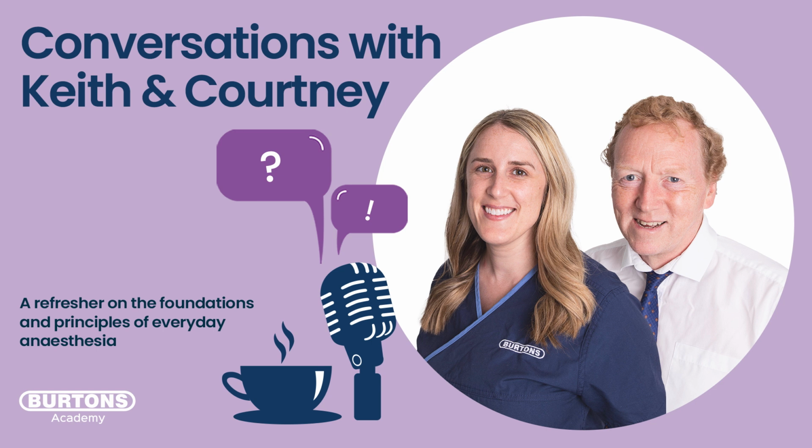No, I think it's really important, because anemia is certainly something I've had in cases before, where we're doing a bone marrow biopsy, for example, and they have a PCV of 9%. These cats are not so bad when their PCV is 9%. If you've got a 9% PCV dog, they're on the floor and I'm in deep trouble. But these cats kind of go, oh yeah, I've had this 9% for 3-4 weeks. Why are you panicking? And then you put that pulse ox probe on them, and their pulse oximetry is normal, and you think, oh, this is fantastic. But actually, like you just explained, it just takes 1 or 2 red blood cells to make that reading really nice and normal. So there is definitely a limitation with anemia.